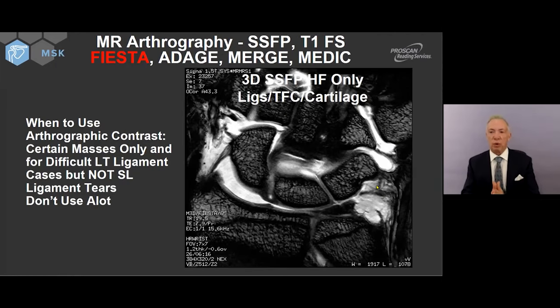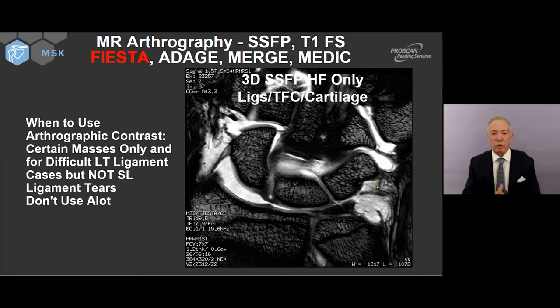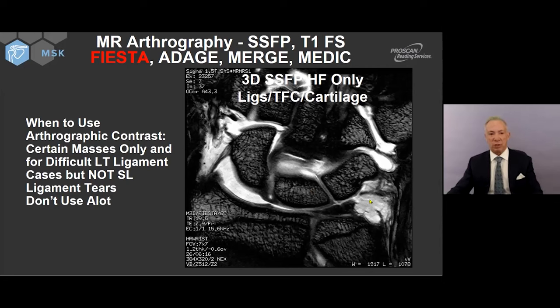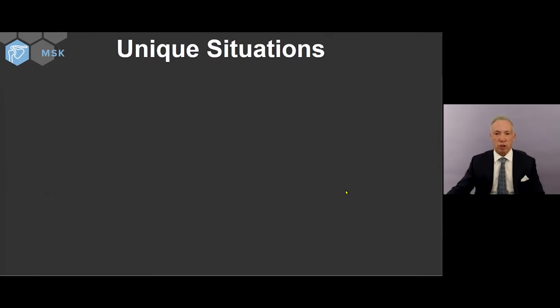A related sequence to the gradient echo sequences is steady state free precession, also known as FIESTA. This sequence gives heavy water weighting and is very robust, allowing you to get the field of view down to around 5-7 with 1 to 1.2 millimeter slices. Look at the band-like portion of the scapholunate ligament — gorgeous. The radial collateral ligament, the lunato-triquetral ligament, which is intact, and some tearing in the periphery of the TFC are all visible. I'm showing this for technique, not necessarily for pathology just yet.